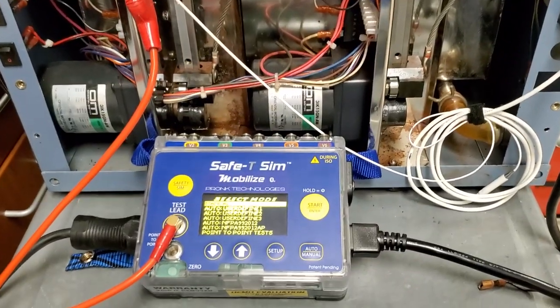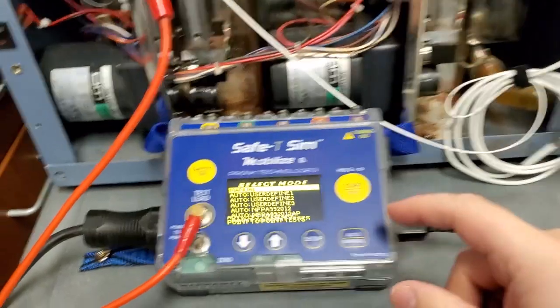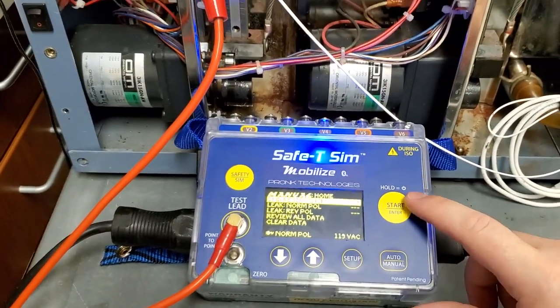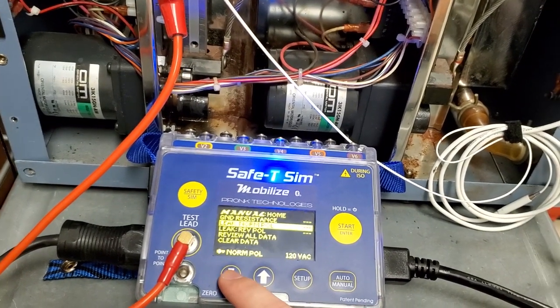For prompt users, you can also monitor equipment current by going into manual mode. I've got manual mode selected, I'm going to hit enter, and you go down to leakage, normal polarity, and enter.